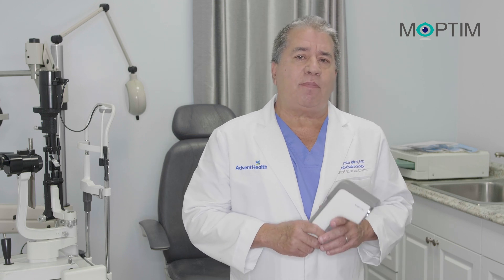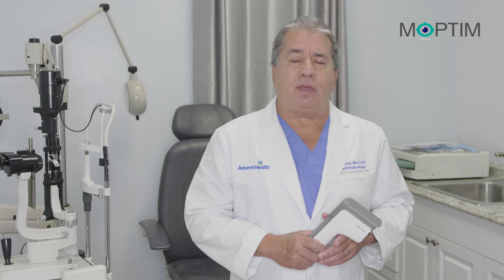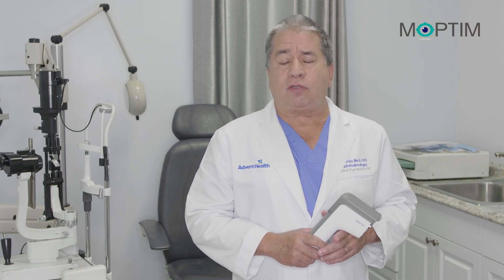And today I'm here to talk to you about the easyRef by Moptim. The easyRef is an autorefractor based on Hartmann-Shack technology, which gives it more accuracy.